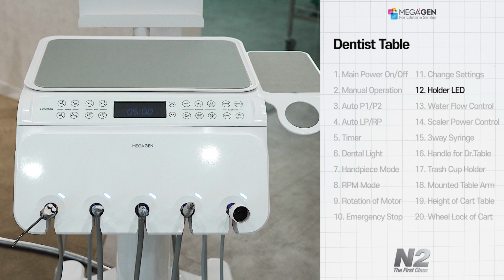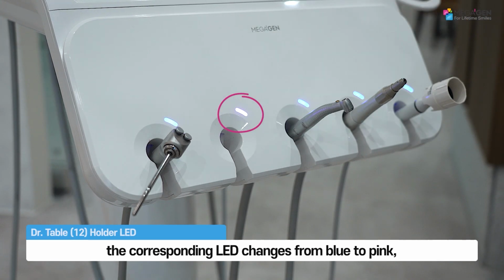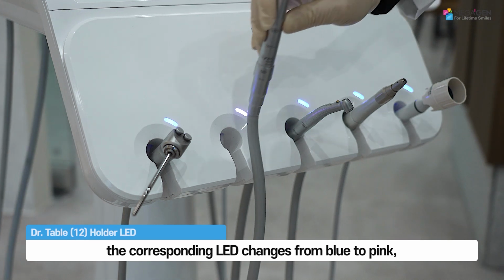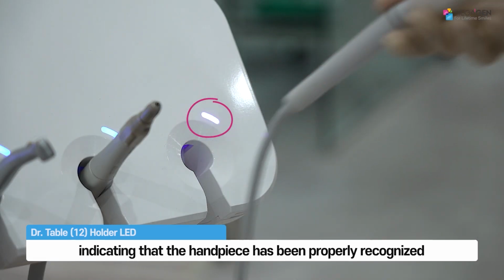Changing the handpiece holder indicator LED color. When a handpiece is selected from the holder, the corresponding LED changes from blue to pink, indicating that the handpiece has been properly recognized.